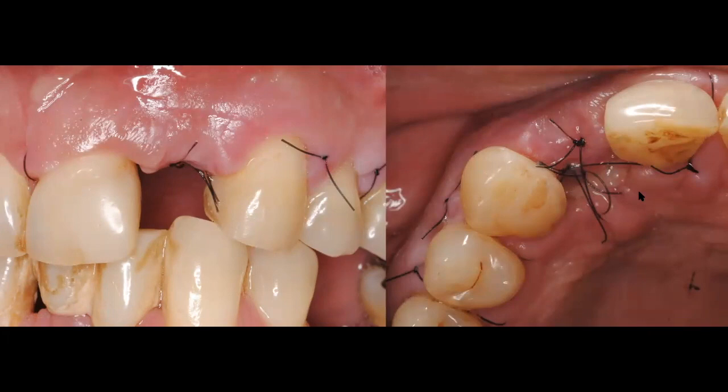So we're just going to go ahead and remove the sutures and just send the patient home. We're going to have him use his Essex. That's what we're going to use. Something that we don't want is any pressure on the site. I would not like to use a flipper or something like that on this side.